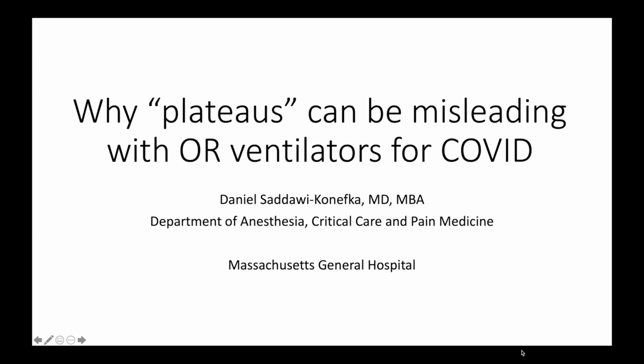All right, this is just a quick recording about why plateau pressures as measured by OR ventilators can be misleading in COVID. And it has to do with resistance that builds up over the HME filters.